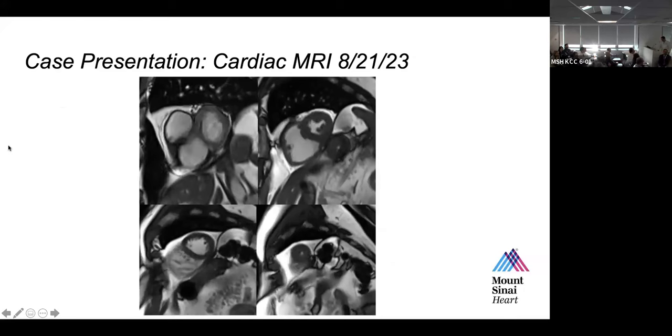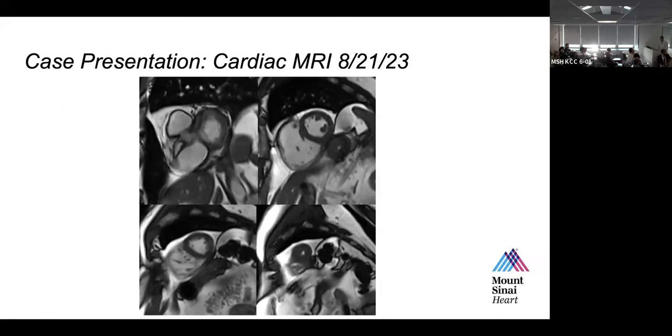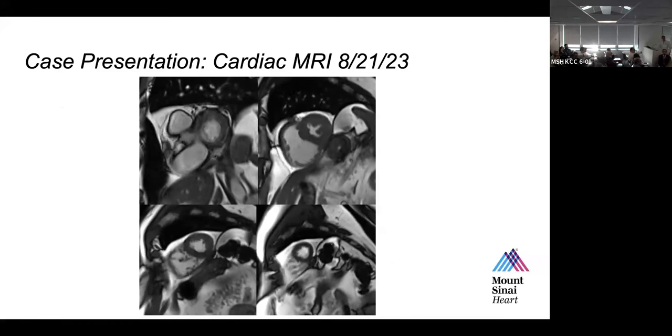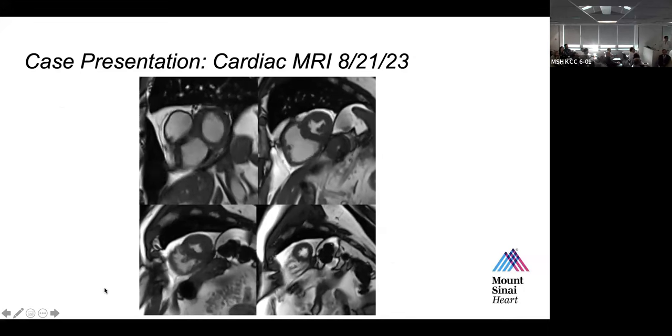So this is just a short axis stack from base to apex. Only 4 views here. Anything to add? The one thing I would add, and is pretty significant here, is that there is diastolic septal flattening. When you look at the septum, it kind of flattens in diastole, you see a D shape.